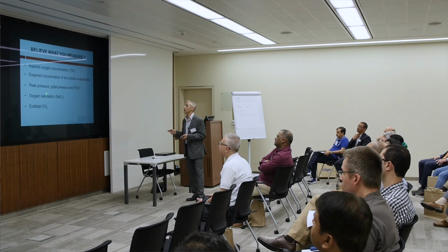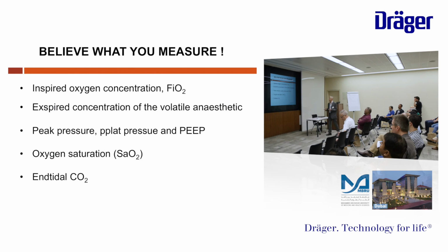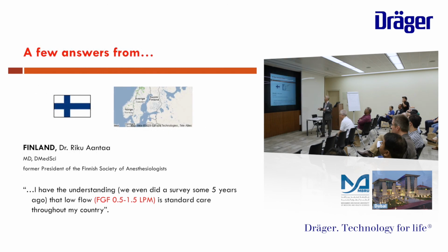How do you know you have a stable inspired oxygen and volatile concentration? Just believe what you are measuring. You have to watch all the time the FiO2, expired concentration, the peak pressure, and the end tidal CO2.